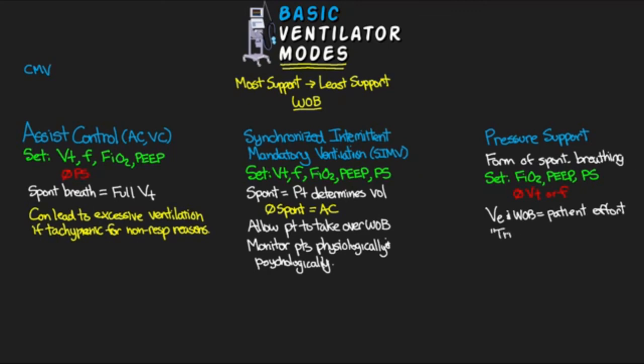So oftentimes you'll see this used as our last step or trial before extubating patients. Typically, if we do have our patients in pressure support and we are doing this spontaneous breathing trial, we'll usually have them set at 10/5, which is 10 of pressure support and 5 of PEEP. Or for a very short run, sometimes we will run them 5/5. And again, this is going to be a short run just prior to extubating.